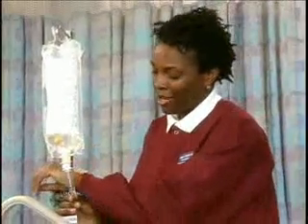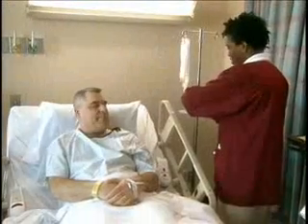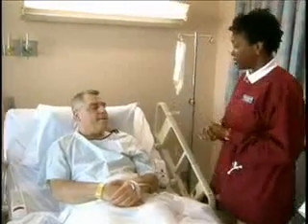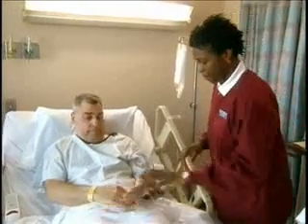And let's just check the rate of flow. Great. The drops per minute match our calculations. So, Mr. Conway, I'd like to check your IV site. Is that okay? Go right ahead.